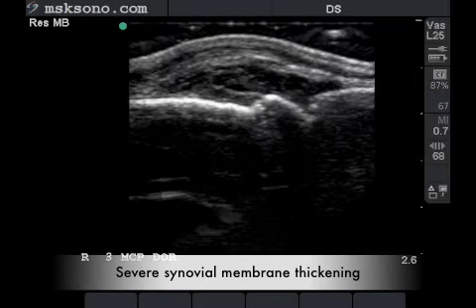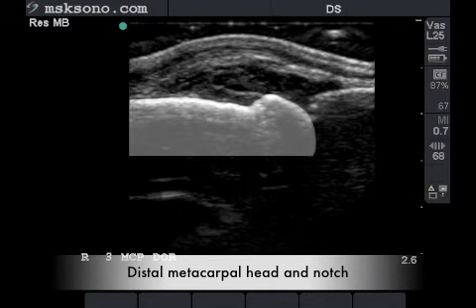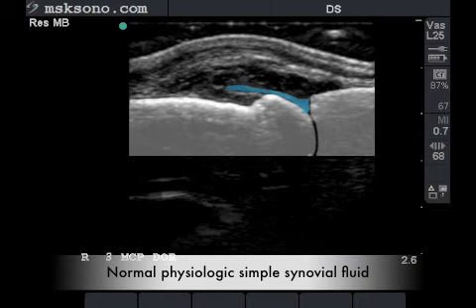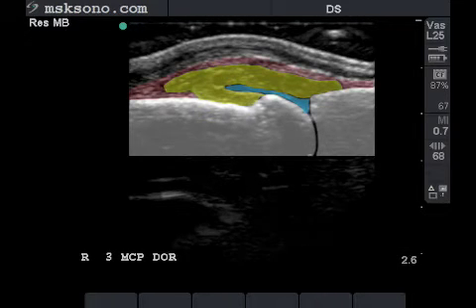The following study demonstrates severe synovial thickening in early rheumatoid arthritis. Here we have highlighted the normal appearing distal metacarpal head and metacarpal notch with no erosion. Here is the proximal phalanx, followed by the normal amount of physiologic fluid and our severely inflamed synovial membrane as it inserts to the metacarpal notch.